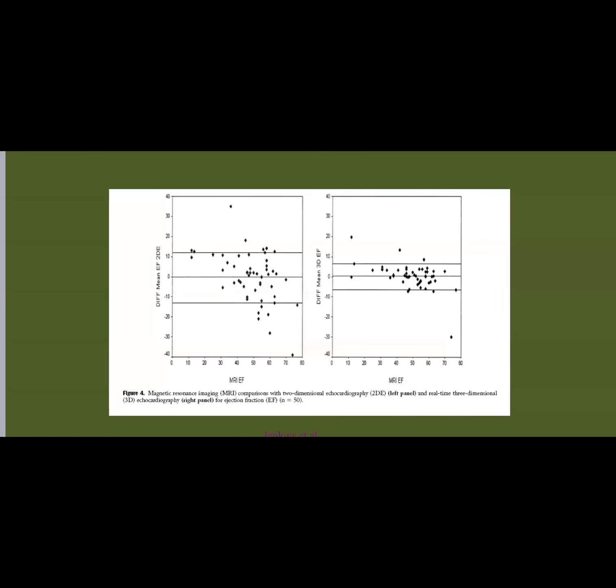Who is doing this and who is doing these studies? Very dedicated, advanced, sophisticated echo labs. You cannot transfer this knowledge down across the mainstream.